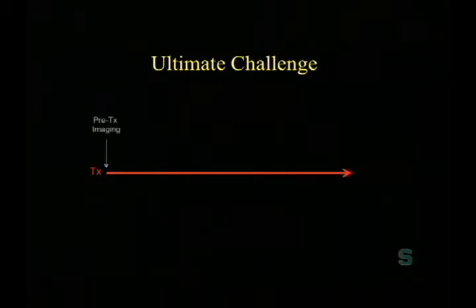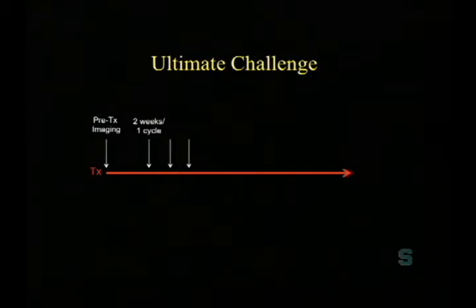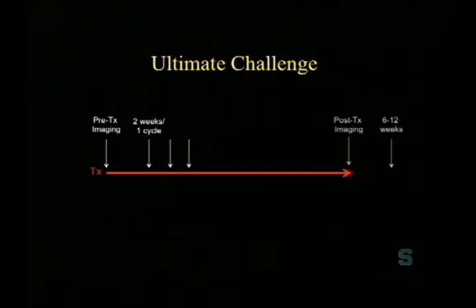But what I'll do, and I'll end with this slide, is the ultimate challenge, because anytime that we start using imaging to try to predict response, we're always faced with this dilemma. We want to try to determine as early as we can whether or not the patients are responding. So we tend to do a lot of things very, very early on in treatment. In fact, after 2 weeks or 1 cycle, so on and so forth.